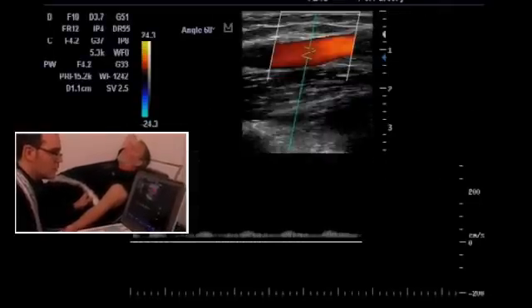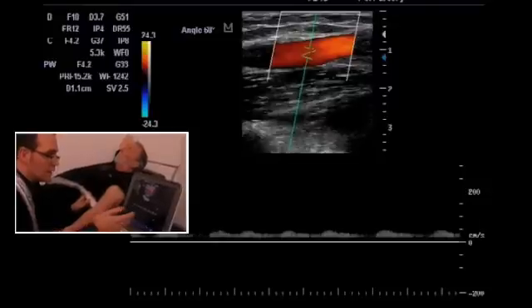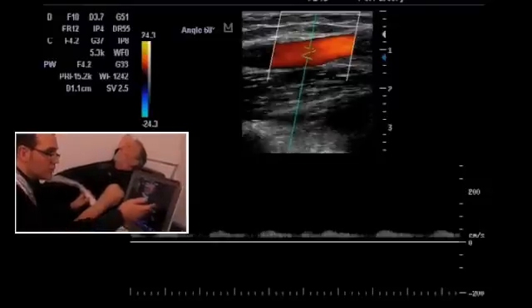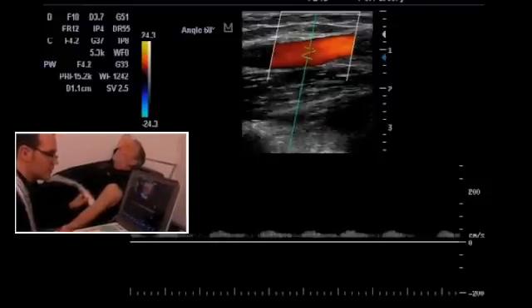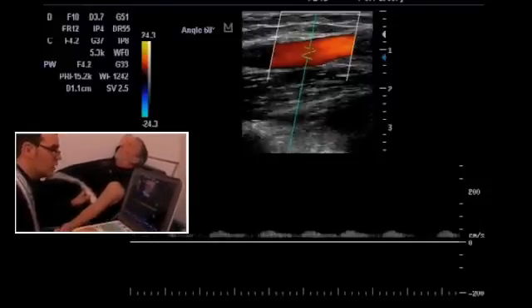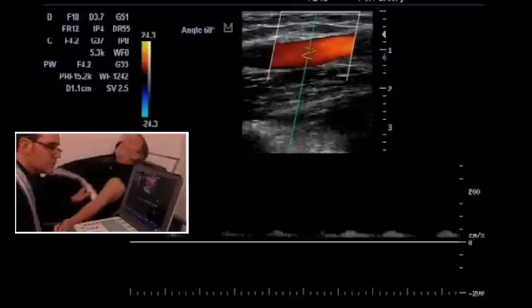Now we see much lower flows. Where we had flows above 2 meters per second, we are now well below it.